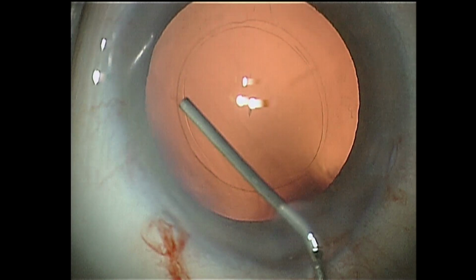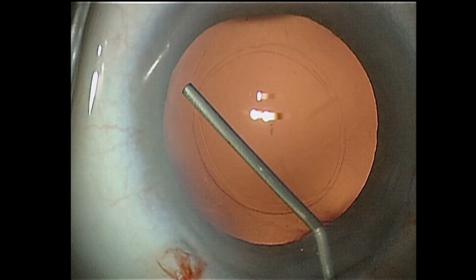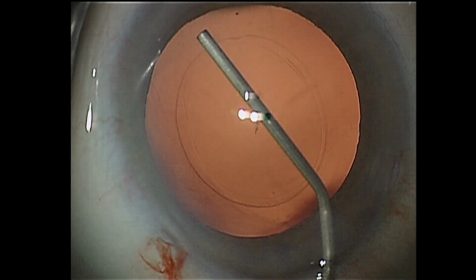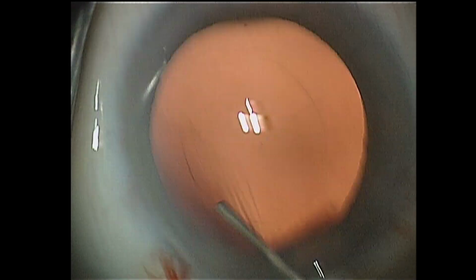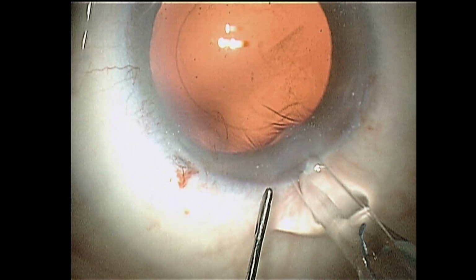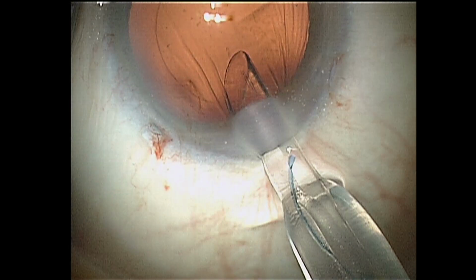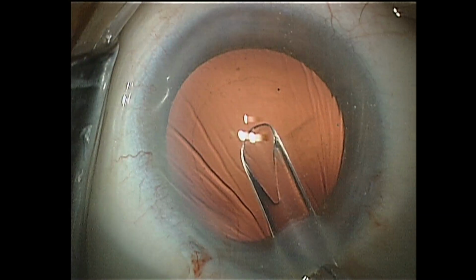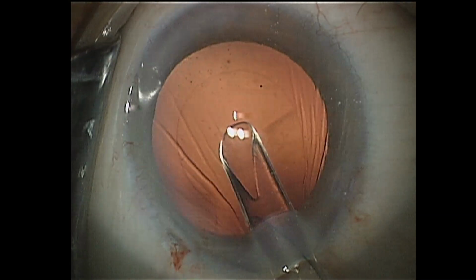Now the nasal capsular fornix is reopened and prepared to accommodate the leading IOL loop. The injector tip is inserted through the tunnel with the slit oriented sideward to exclude tissue trauma, to then be rotated clockwise to allow the leading loop to exit horizontally and settle in the reopened nasal fornix.